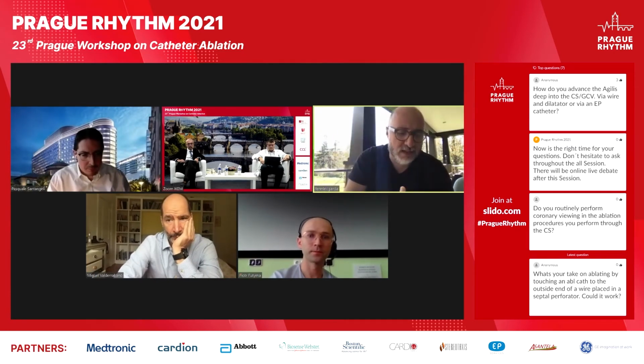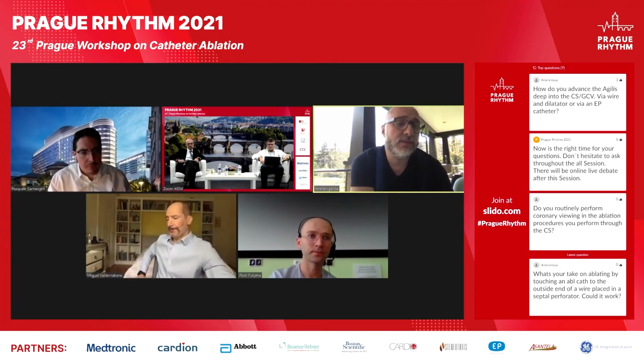So it's an approach in which I do the same thing for every patient every time, and that's how you get used to it. It becomes very fast, 10 minutes usually. It all depends on the anatomy, of course, but I do the same thing for every patient always that suggests LV outflow tract origin of the PVC.